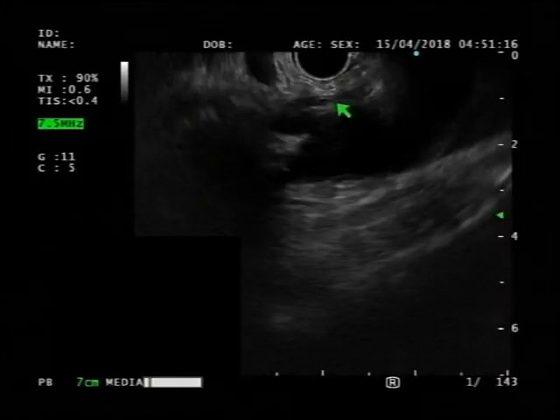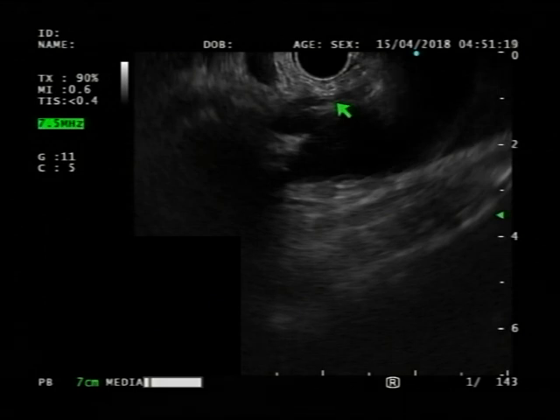If you go clockwise, you're going to the patient's left. So what you want to do is not stand actually like this, but turn your body a bit like this. So you orient yourself. You're here. If you go clockwise, you're basically facing the back.